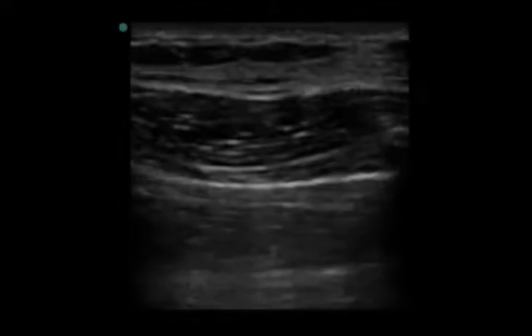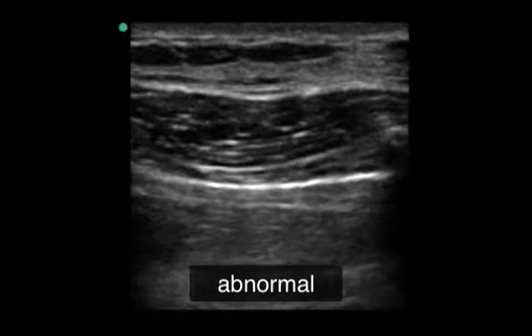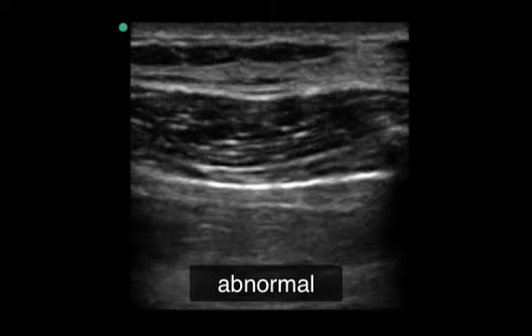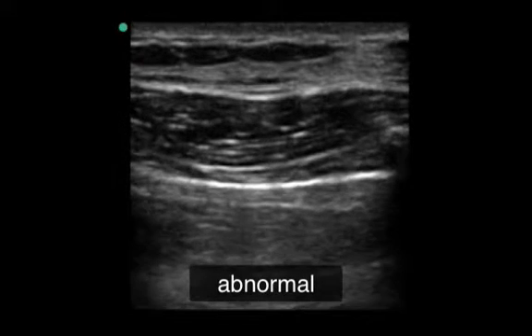If instead you see a flat pleural line, this suggests that air is in the pleural space and a pneumothorax is present. In pneumothorax, air enters this potential space and scatters the ultrasound beams before hitting the physiologic pleural fluid or the second pleural membrane. If you do see a pneumothorax, confirm it by stepping into M mode.